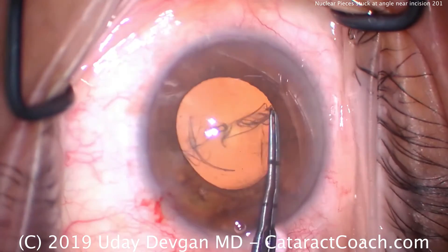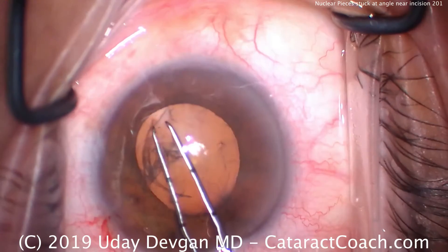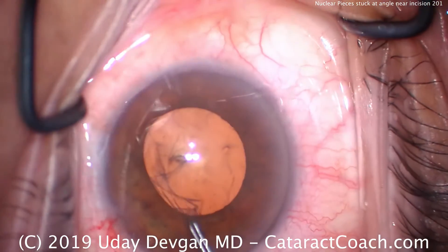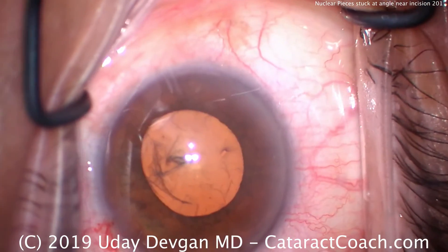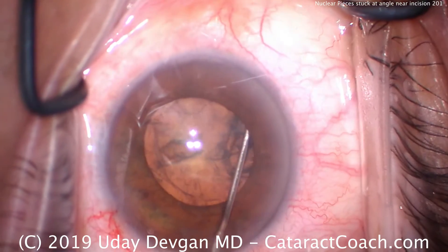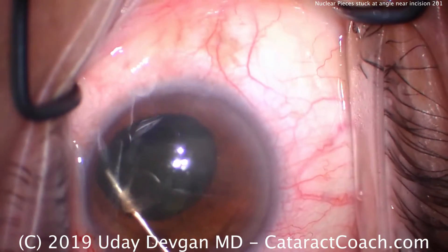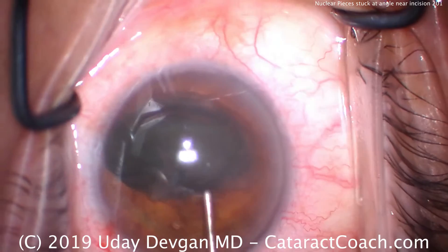In a case like this with a pupil that's mid-dilated at best, I like to prolapse the nucleus out of the capsular bag. This is not a very dense nucleus, so it makes it relatively easy to do that. Here comes the balanced salt solution on a blunt cannula for the hydrodissection. We get a fluid wave, another wave, and there's the nucleus. We'll use the cannula to help tilt the nucleus, and now we effectively have the iris holding the nucleus for us.